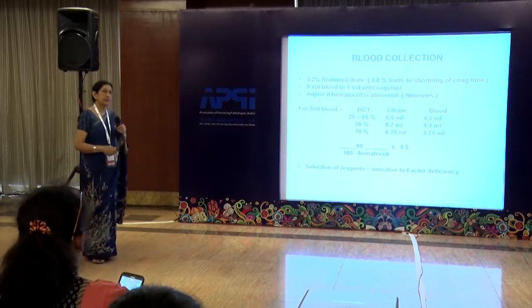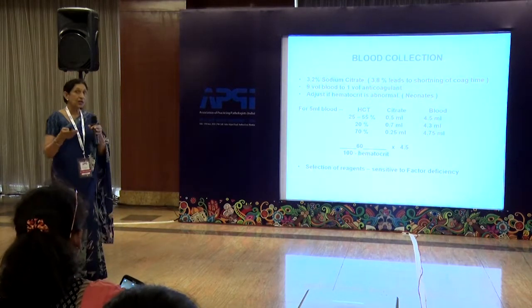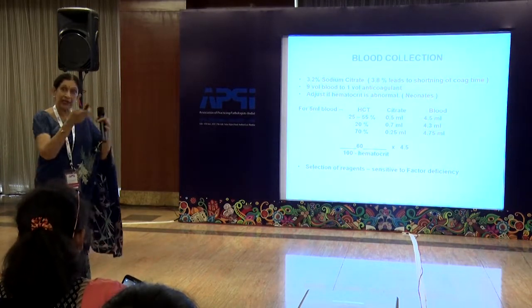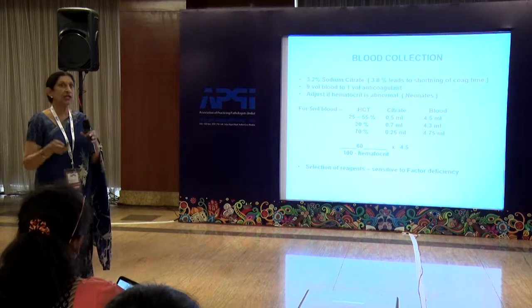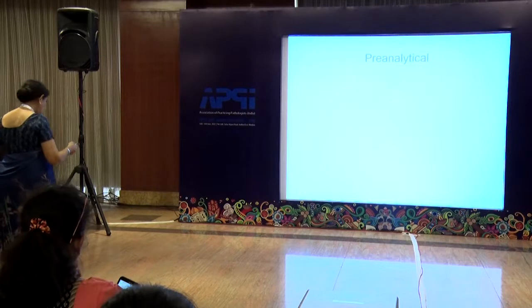Selection of reagents is very important. You have to pick reagents based on your need. Are you a coagulation testing lab? Or are you supporting your gynecologist for a bad obstetric history, for an inhibitor like lupus anticoagulant? Please select your reagents carefully. I'll come to this a little later.